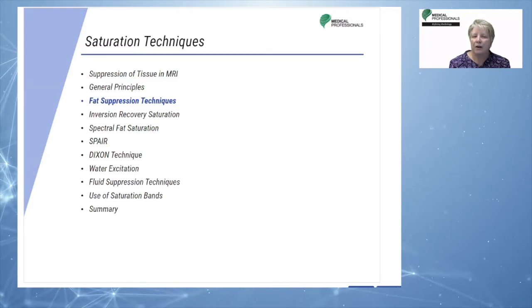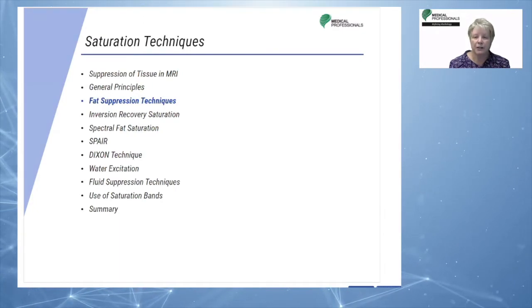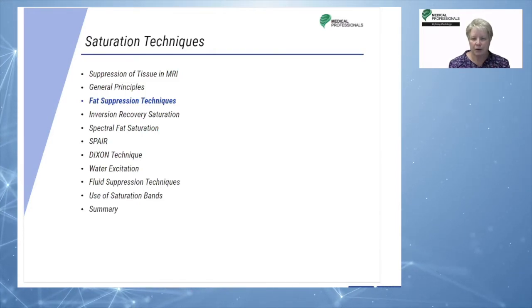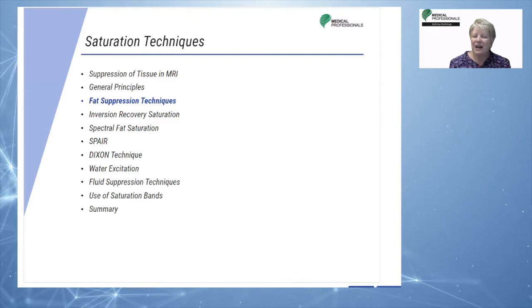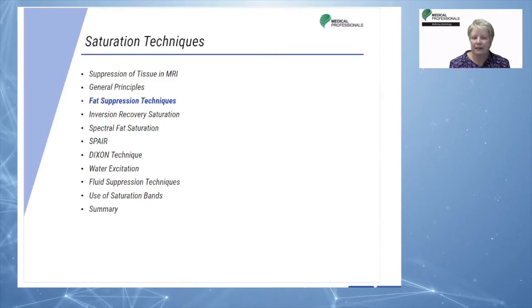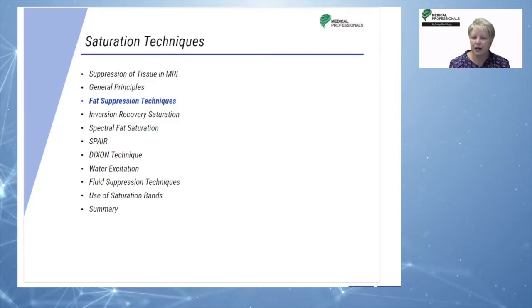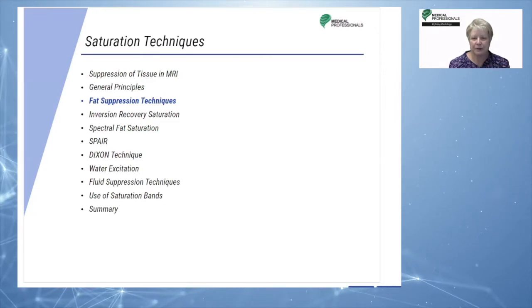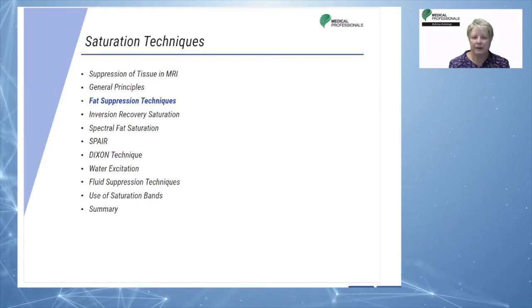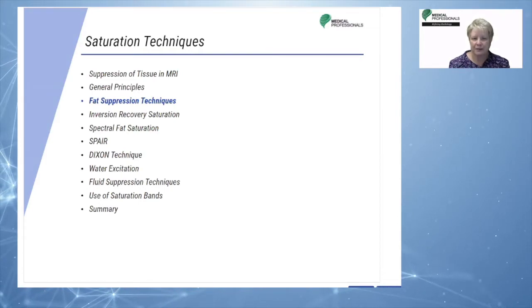These are IR. IR stands for inversion recovery. A common inversion recovery technique is STIR, S-T-I-R. I'm sure everybody's heard these, right? Next is spectral fat suppression, which is SPAIR, which is a combination of IR, the inversion recovery, and the spectral fat suppression. Another is Dixon technique, D-I-X-O-N, and the use of water excitation to suppress fat.